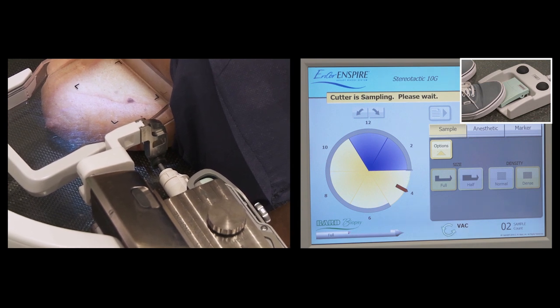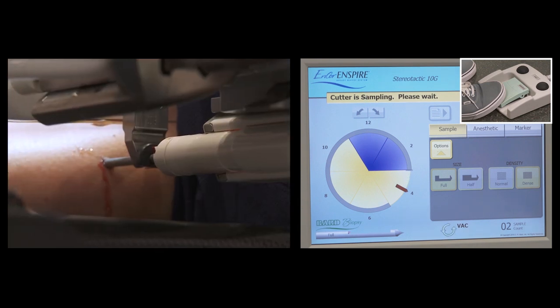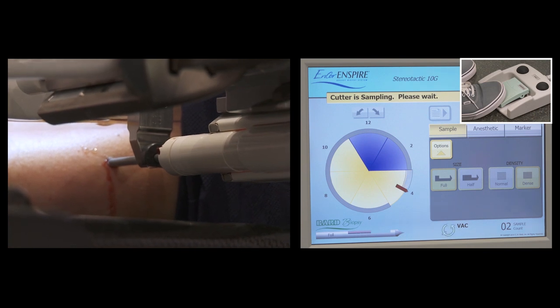Continue sampling until the tissue is representative. 12 samples are recommended.